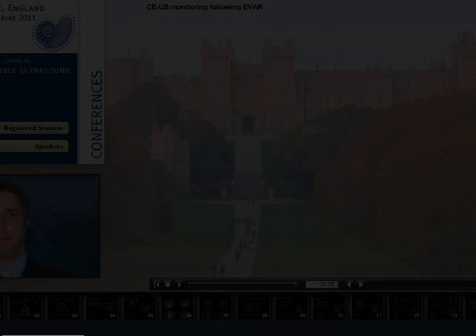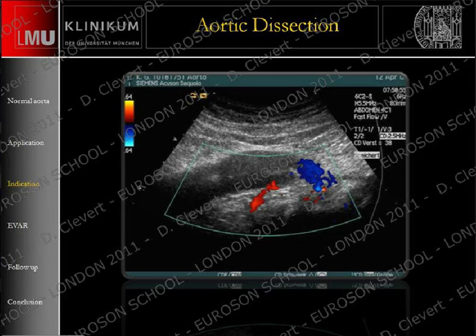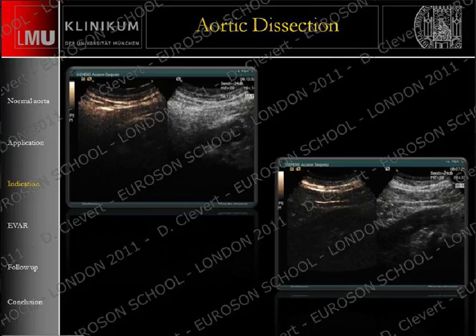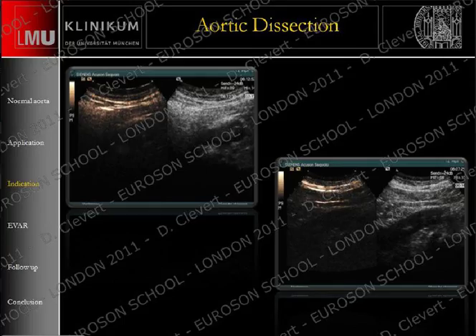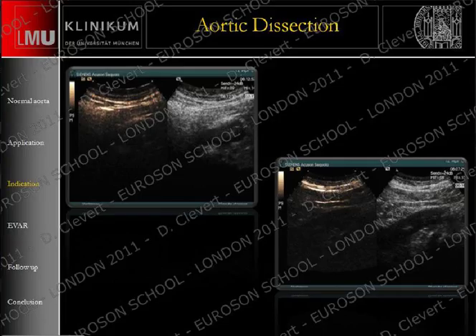Where do we find more information by using contrast-enhanced ultrasound? Starting with the axial view using side-by-side technique, in most cases contrast arrives first in the true lumen. We can identify the true lumen, the false lumen, the right renal artery, and also in the longitudinal view, we see the true lumen, false lumen, and right renal artery. The left renal artery is not visible in this patient because this patient has only one kidney. After documenting the dissection, we also use the time to examine the right kidney.